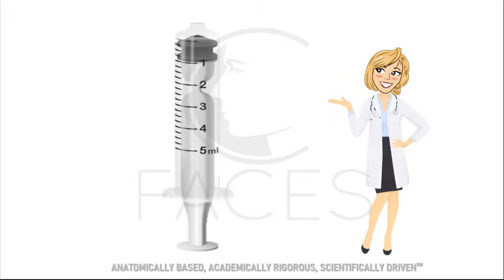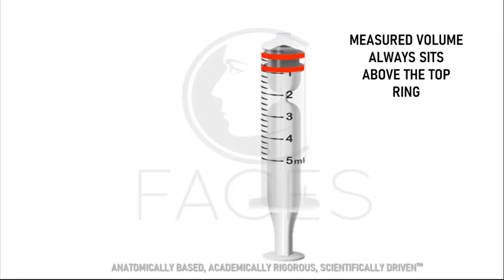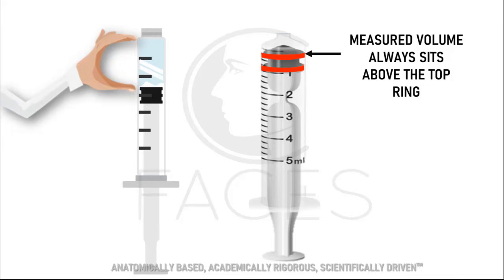You'll notice that the plunger seal or stopper has a bottom ring and a top ring. The top ring acts as an indicator for measuring the amount of medication within the syringe, meaning the measurable medication is always above the top ring of the stopper.